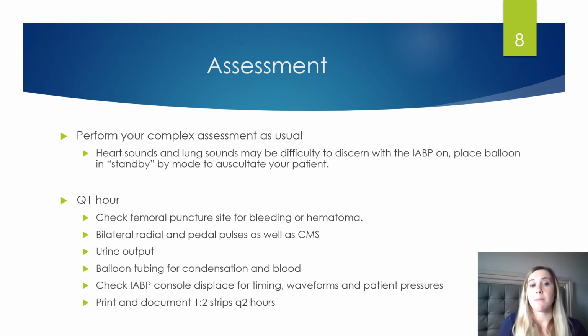You're also going to be checking bilateral radial and pedal pulses, as well as just your CMS, your integrity. Is the hand nice and warm? Does she have good cap refill? Are you able to palpate the pulses? Is the foot all of a sudden cool, cold, and you're not able to palpate pulses?